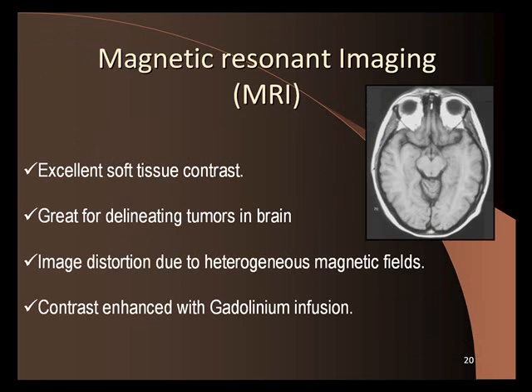Have you guys seen DRRs on the treatment planning computers yet at NIRA? Okay. So it's not totally.